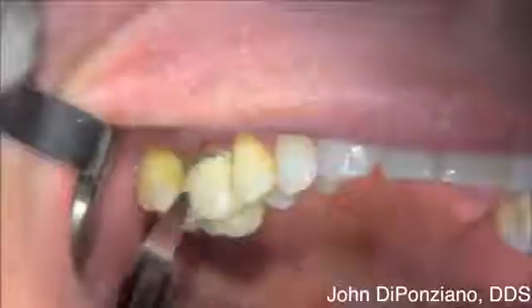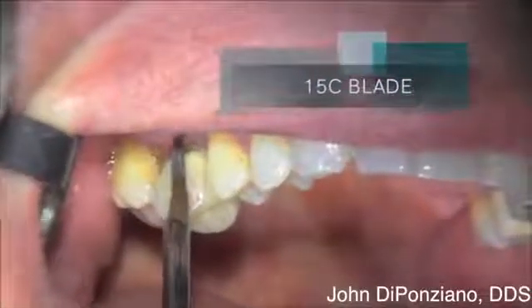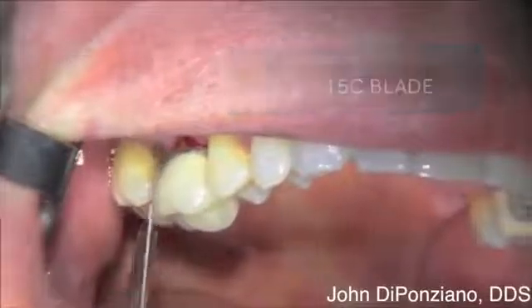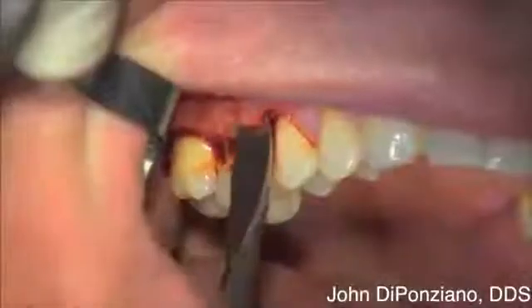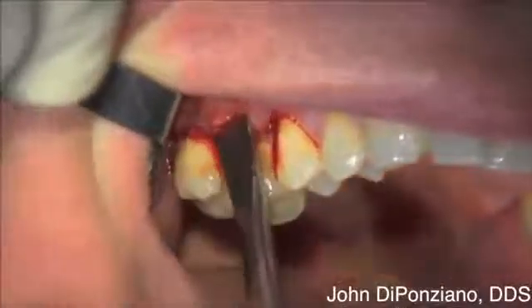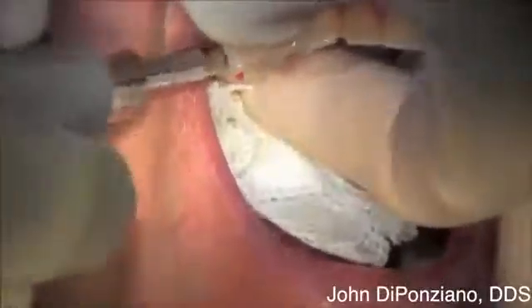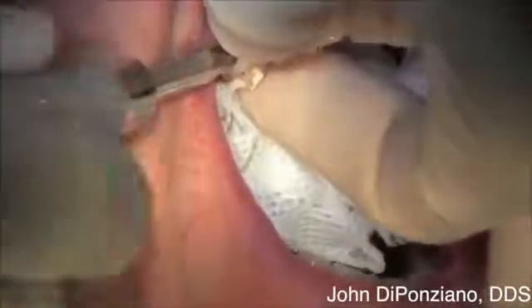This is a maxillary right first molar with a nine millimeter pocket on the distal facial root and furcation involvement. We're going to extract this tooth, first using a 15C blade to go around the PDL, a couple of millimeters buccal and lingual, then a periosteo elevator to release the flap with the periosteum intact on the flap, and a coarse diamond to cut through and remove the crown.